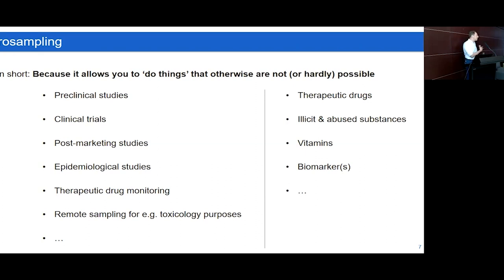We've also been working on vitamins, to do some epidemiological studies on vitamins, but also on biomarkers to monitor health, as it's being referred to, or to monitor some really dedicated specific biomarkers that you're interested in. So many of these things require quite a substantial effort if you want to set it up just via conventional recruitment of patients. And it's greatly simplified if you could use microsampling.